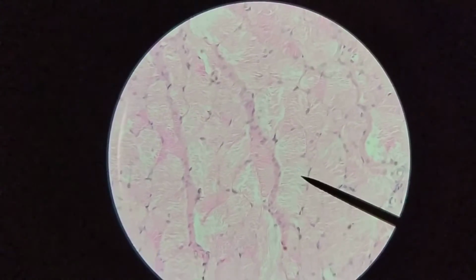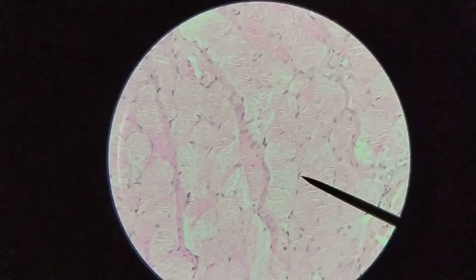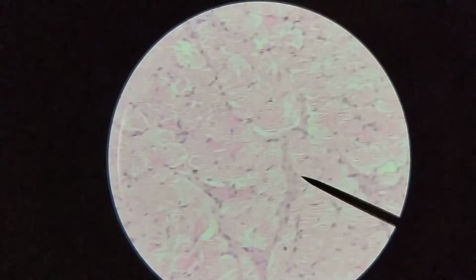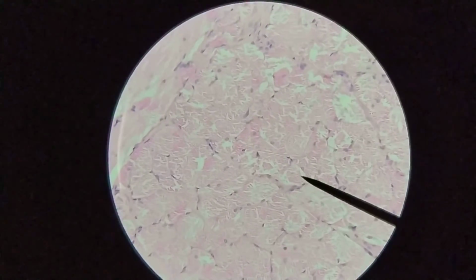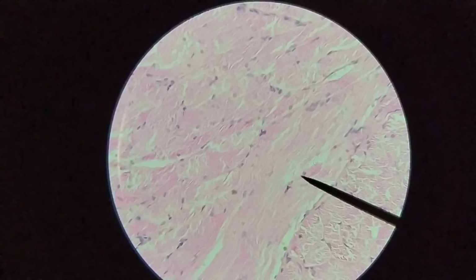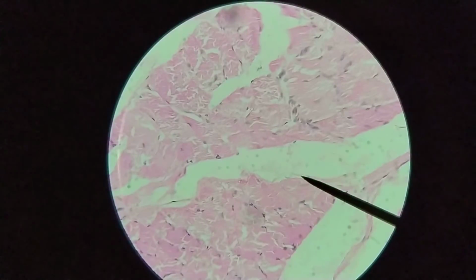But you can see that the nuclei are all peripheral here, and the cells themselves are filled completely with this eosinophilic material. So we're now looking at skeletal or striated muscle. This is a cross section through it, and here's more of a longitudinal section over here. The layers seem to be reversed, and that's because we're looking at a longitudinal section through the esophagus instead of a cross section.